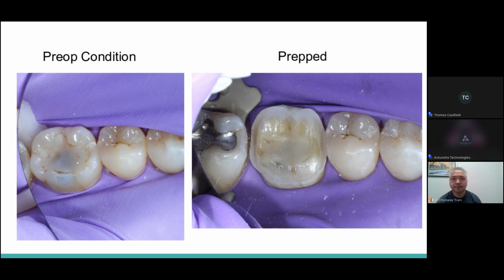All right. Slide. So this is just a basic walkthrough. We have a tooth with an obviously failing composite. Like I said, this is a prep for an onlay, crownlay, call it whatever you may. But the idea is a nice clean prep with supragingival margins, nice clear margins, and smooth corners. And basically, this is a great case for a resin type of restoration.